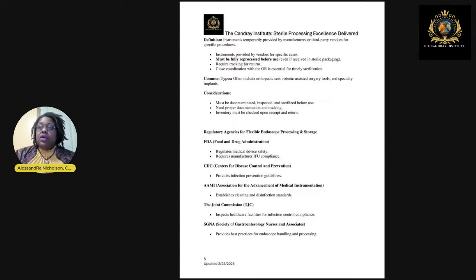You don't want to be responsible for replacing a set that nobody wanted to buy in the first place. And then lastly, when you're receiving loaners, make sure that you are closing the communication gap with your sterile processing leadership team and with your OR team. It's essential for them to know. It may be your service line leader, it may be a service lead, but it's essential for them to know what instrumentation is in the building for them and available for their use. You also want to know who to hunt down if you need to go looking for something, okay?